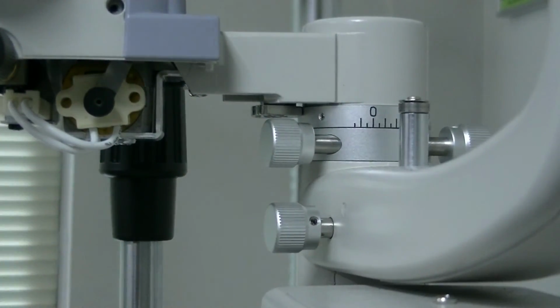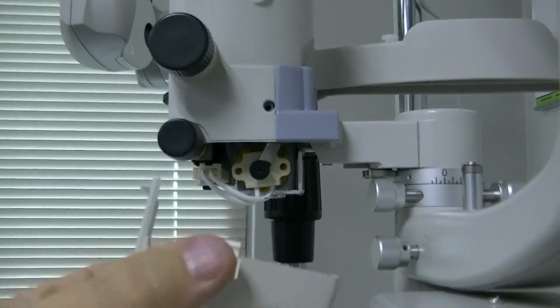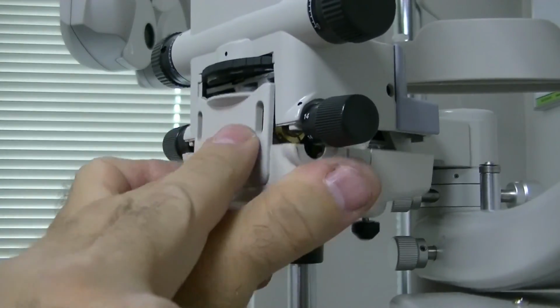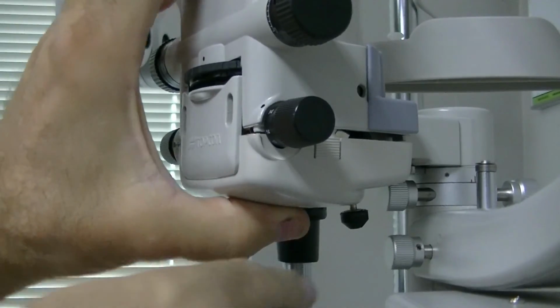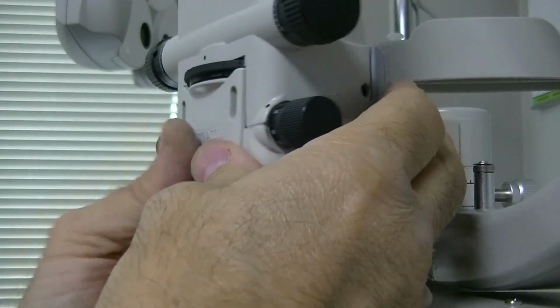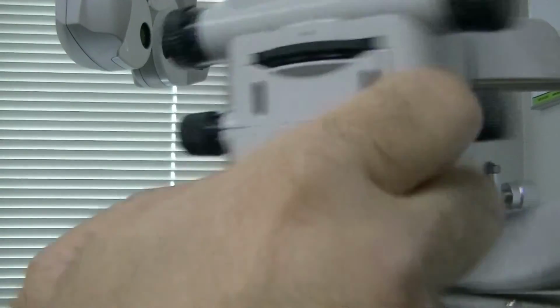Now, once you're done with that, you have to put it all back, you have to put the cover back on. Simply take your cover, align it up so that this part right here is flush against this side piece where the filter wheel is, so that they're lined up like that. Push it up and it will snap in place in all these spots. And once it snaps in place, then you simply just tighten the screw back up and in. Got to make sure it's flush and even on both sides.